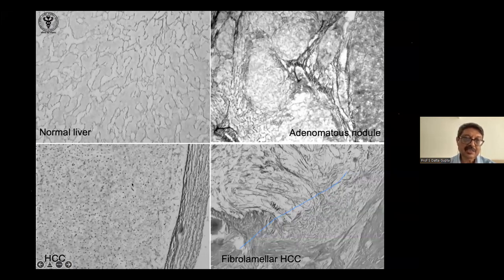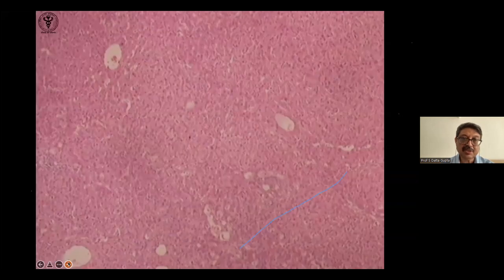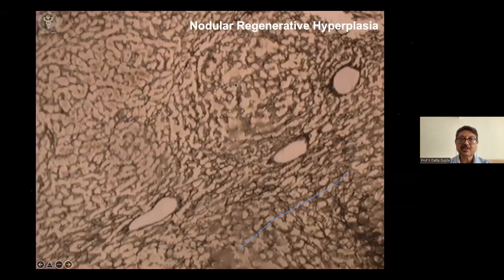In an HCC, generally the reticulin is lost. This is a poor man's way of telling that you're dealing with HCC. In an adenomatous nodule, there is a partial loss of reticulin. Because the sinusoids are not formed well in HCC, the reticulin gets lost. So this is a cirrhosis, biliary type of cirrhosis. Reticulin is helpful in other conditions. This is a case of portal hypertension, looks almost normal. But when you do a reticulin stain, you'll find this. This is a nodular regenerative hyperplasia. This nodule wouldn't have been seen clearly otherwise.